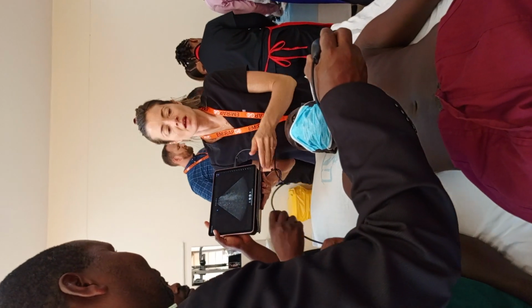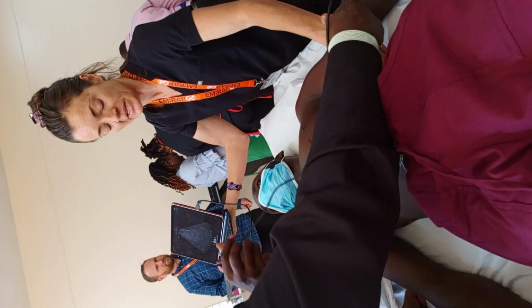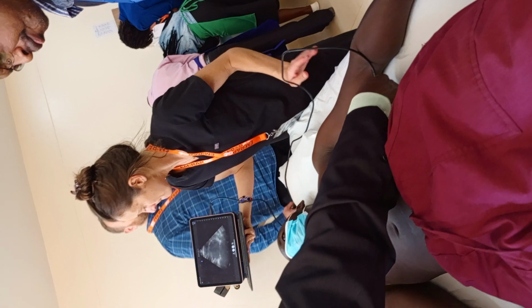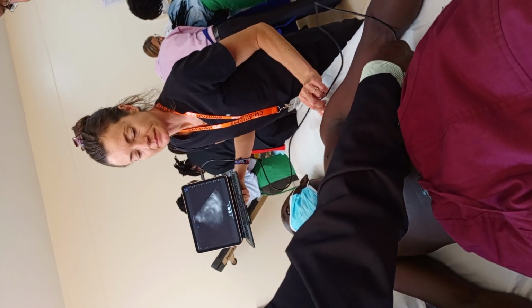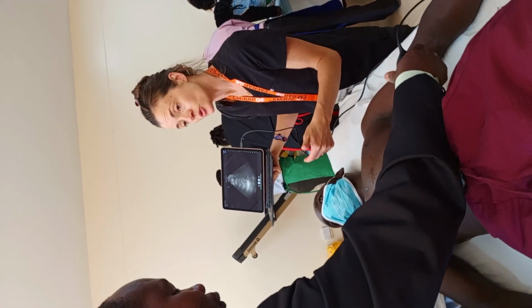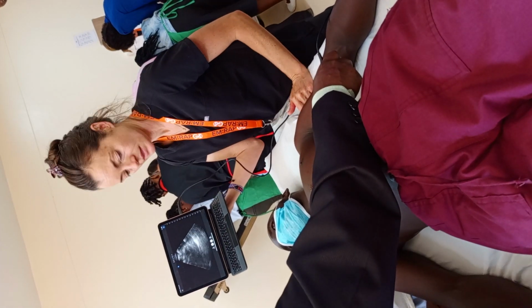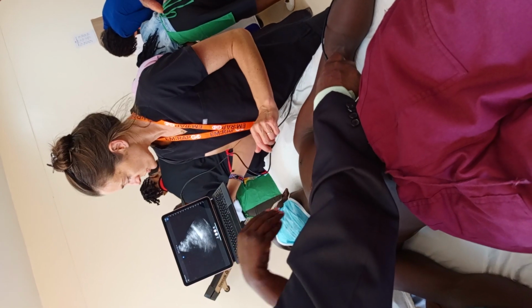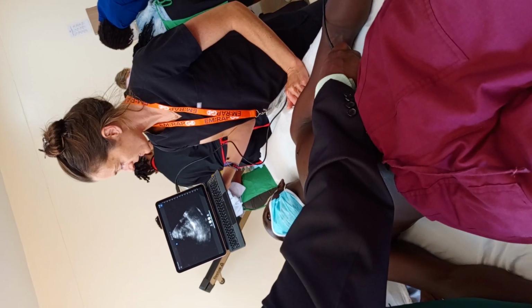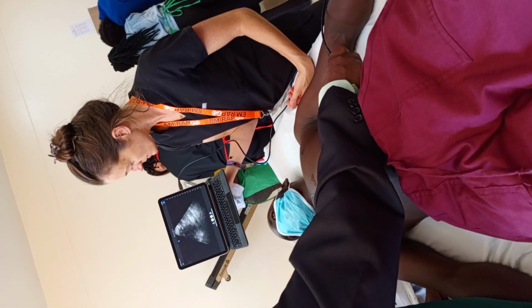Now remember this one. If you hold the probe like this, I always tell my residents it's knuckles towards the bed. So it's much more down towards the bed. And up towards, also, where's your indicator? So the indicator should face up towards his head. So you need to go a bit further down. You have kidney, and then slide up a bit towards his head.